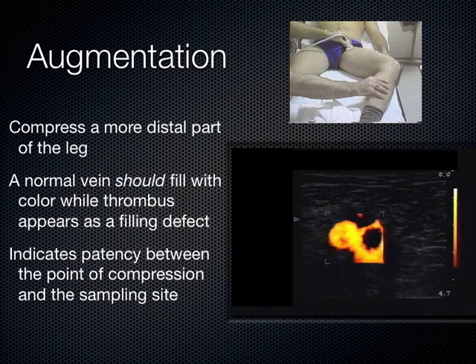And for years, people got really into this augmentation. However, it has largely fallen out of favor because it doesn't have good test characteristics to diagnose a DVT or not. And so you can't rely on augmentation. It's a fun thing to do. I do it all the time. It's sort of a geeky ultrasound thing I love to do, but I can't rely on it.